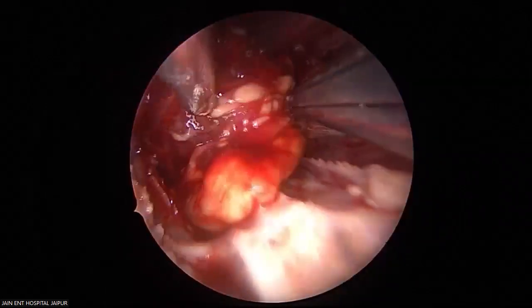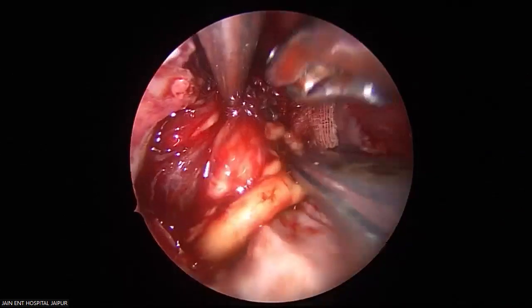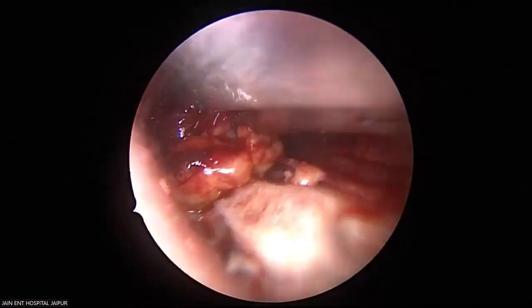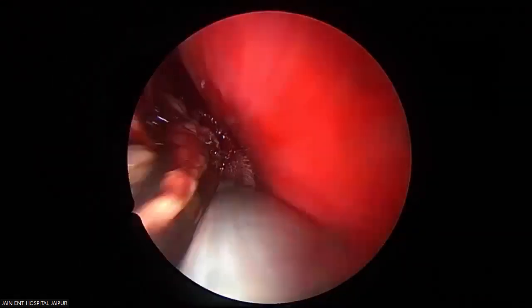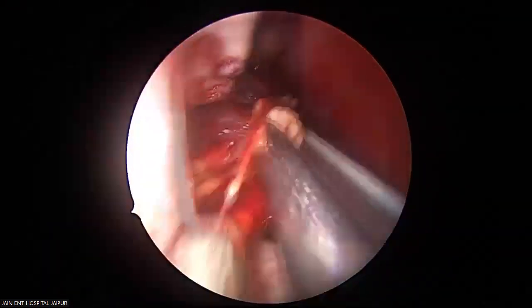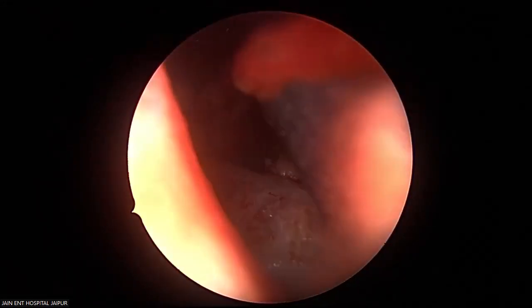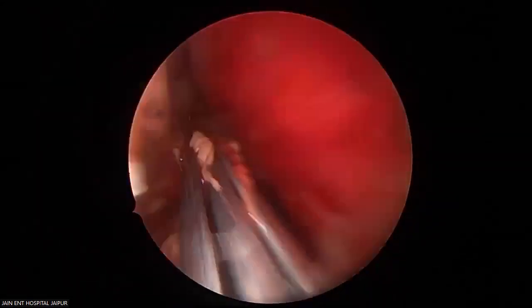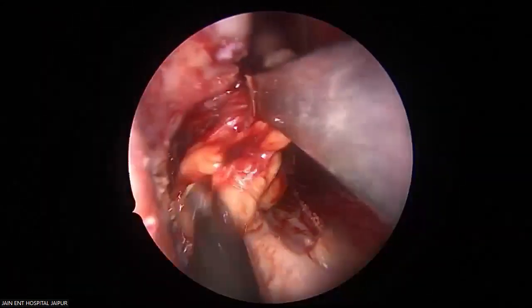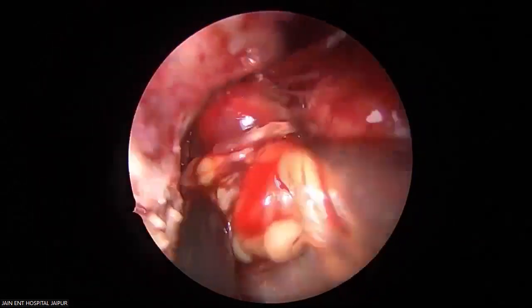Yeah. And the surface doesn't have any adhesions. When we pull it out, there is no bleeding. The tumor is pushed. Yeah. So I have removed my gauze piece. Yeah. Hold from the front, hold from there. Hold.